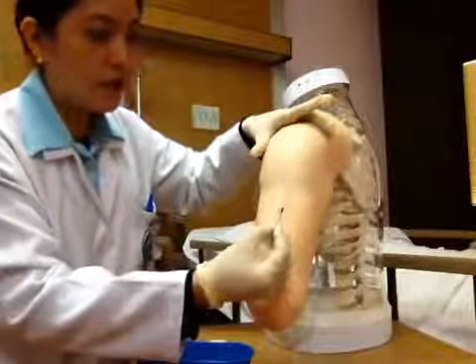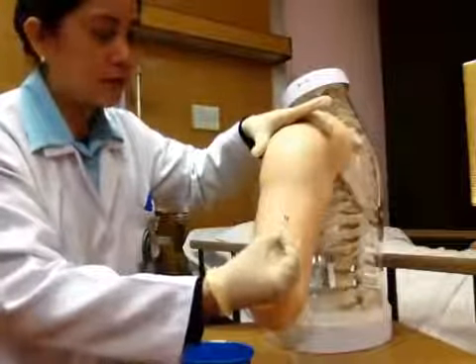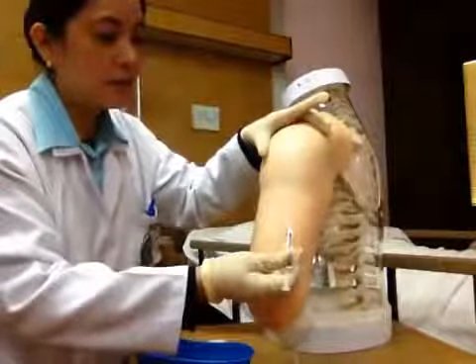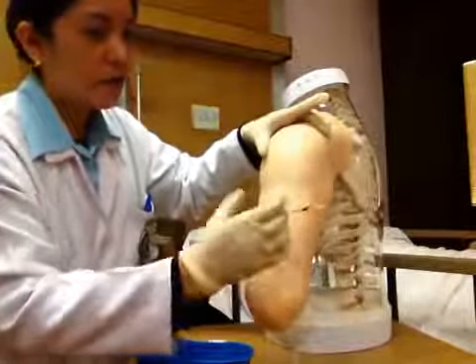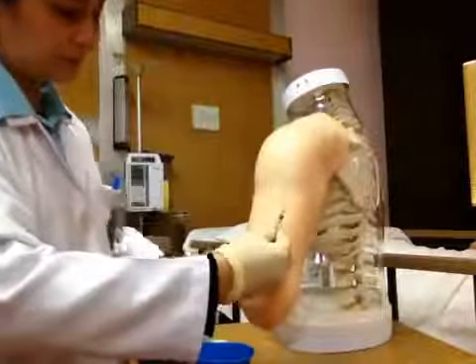Get your insulin syringe with medication inside, at an angle of 45 degrees. If the patient's muscle is just a moderate body build, you can do it at a 45 degree angle. But if your patient has a big body, then you can do it at a 90 degree angle. So here I'm going to show it to you at a 45 degree angle.